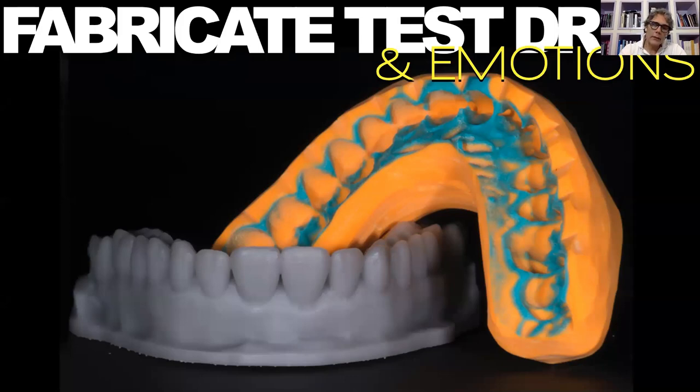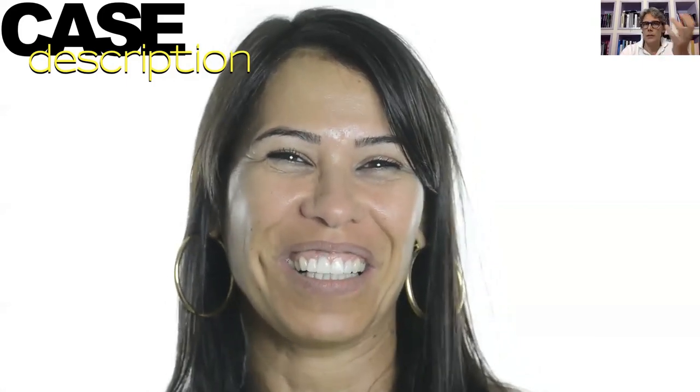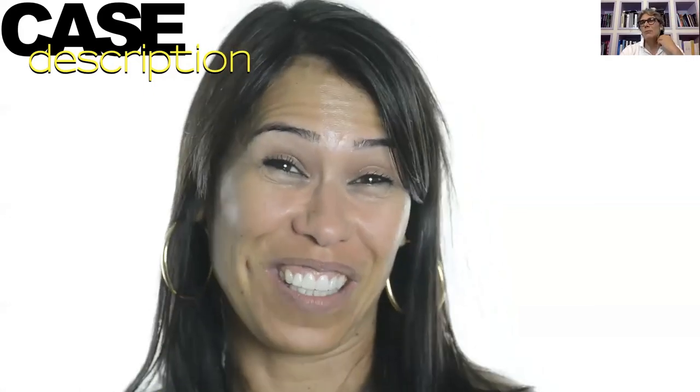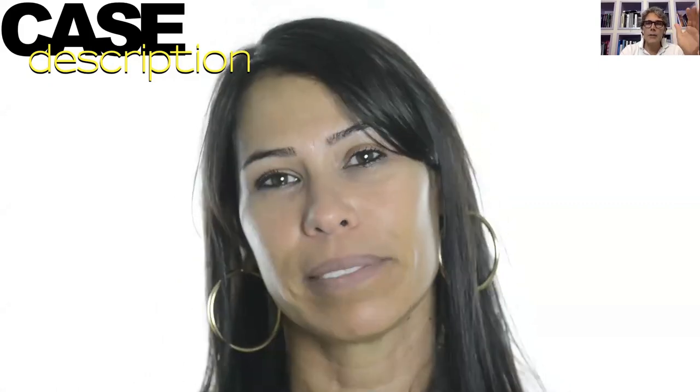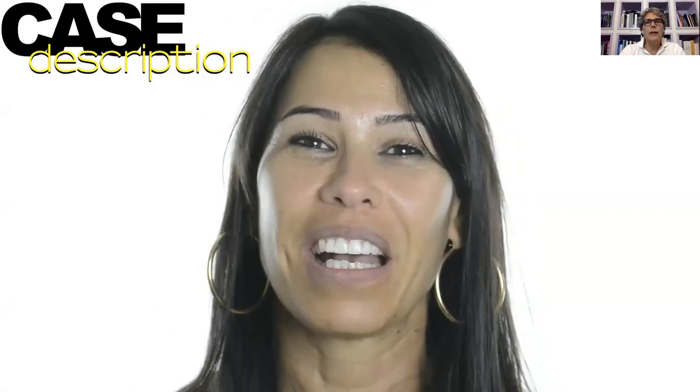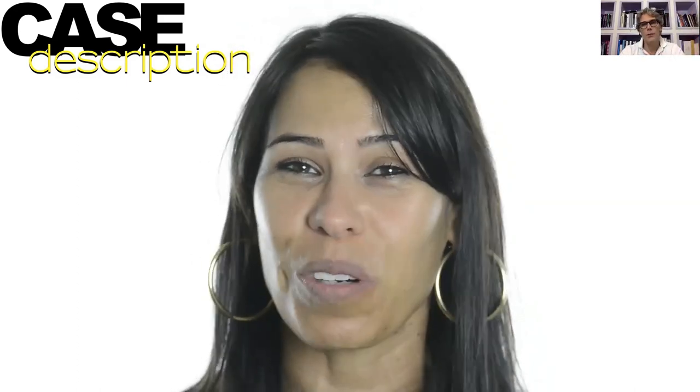At the end of this step, I have to test the mock-up by recording a video that allows me to check exactly the relationship between the incisal edges and the lower lip of the patient in a dynamic phase. This is crucial, because sometimes pictures in shy people are not sufficient to discover, for example, if the patient has a gummy smile or not, or the relationship between the incisal edges and the lower lip in profile view from a frontal perspective.